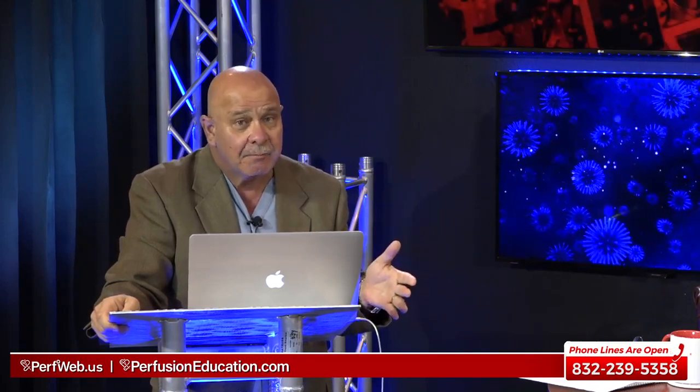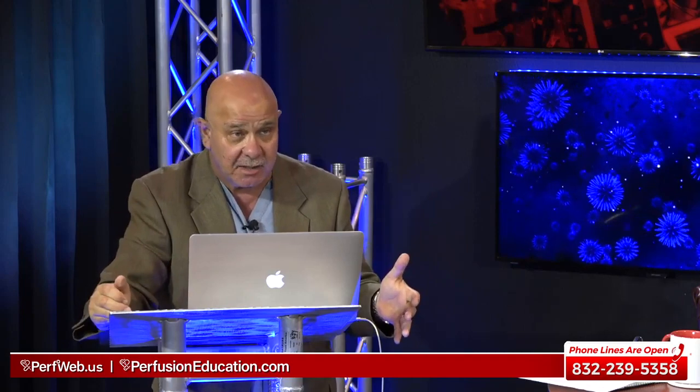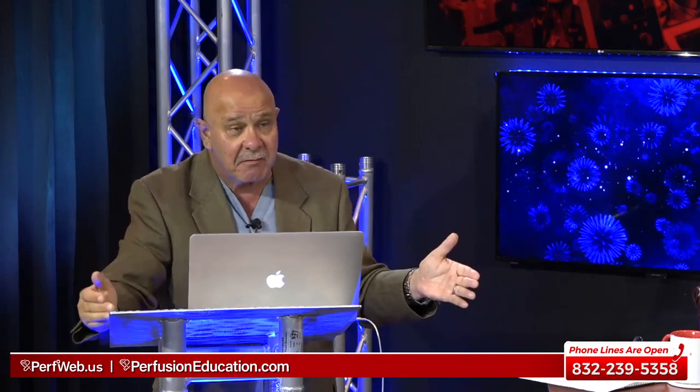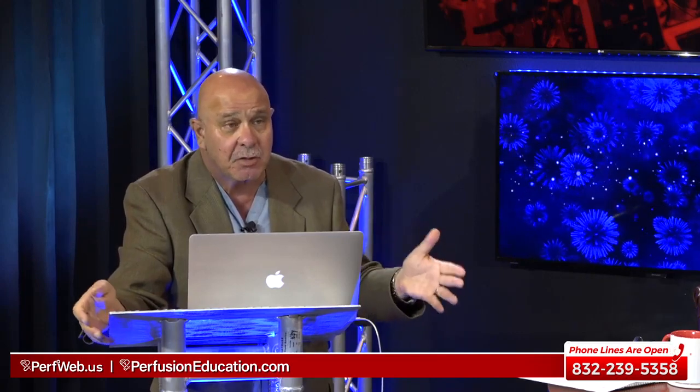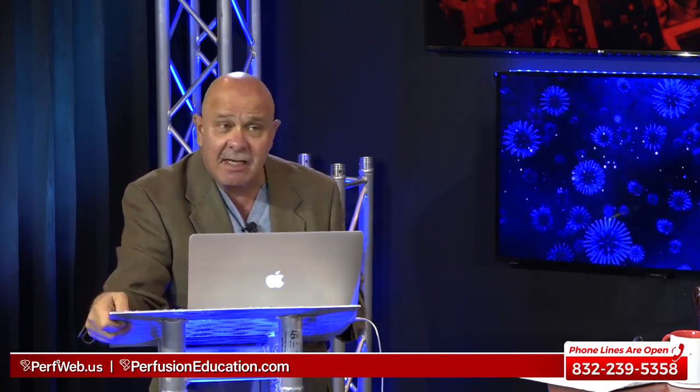But I have a friend of mine who has actually done 2 independent ECMO circuits on 1 patient, VV, to have enough flow to accommodate the patient's cardiac output, so they did not still have a diminished oxygen saturation going to their head. That's what it took. Their cardiac output was about 15 liters, and they had to use 2 separate VV ECMO circuits in that patient. Now, the caveat is you have to be very careful where you put the tubes, because you can get a lot of recirculation, and even though you have a lot of flow, it may not necessarily be effective flow. So you really have to think through your cannulation.